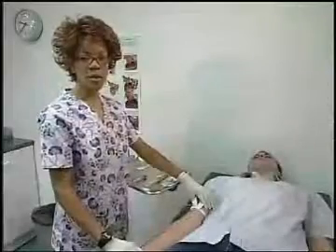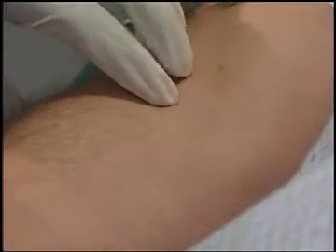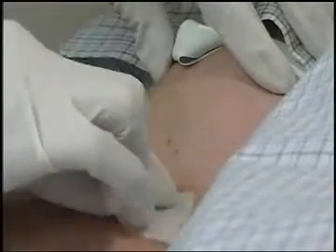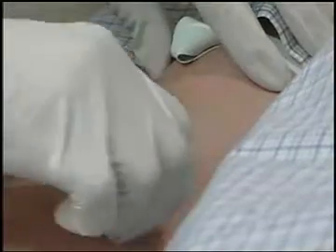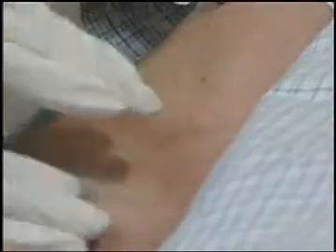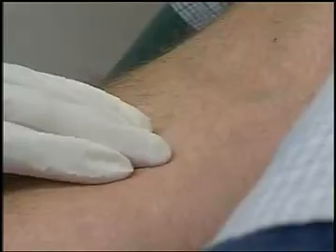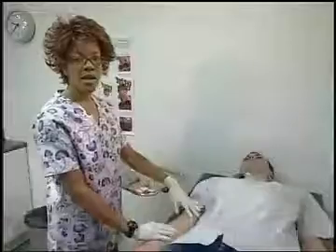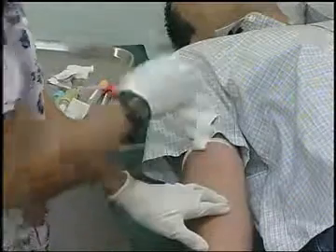Next, palpate the vein with your fingertips like so. If you can't feel a vein, try the other arm. Prepare the site with an alcohol pad by rubbing in a circular pattern beginning at the insertion site. Then stabilize the vein with your non-dominant hand 2 inches below the insertion site and pull the skin towards your other hand. Now you're ready to insert the needle while holding onto the holder with your dominant hand.